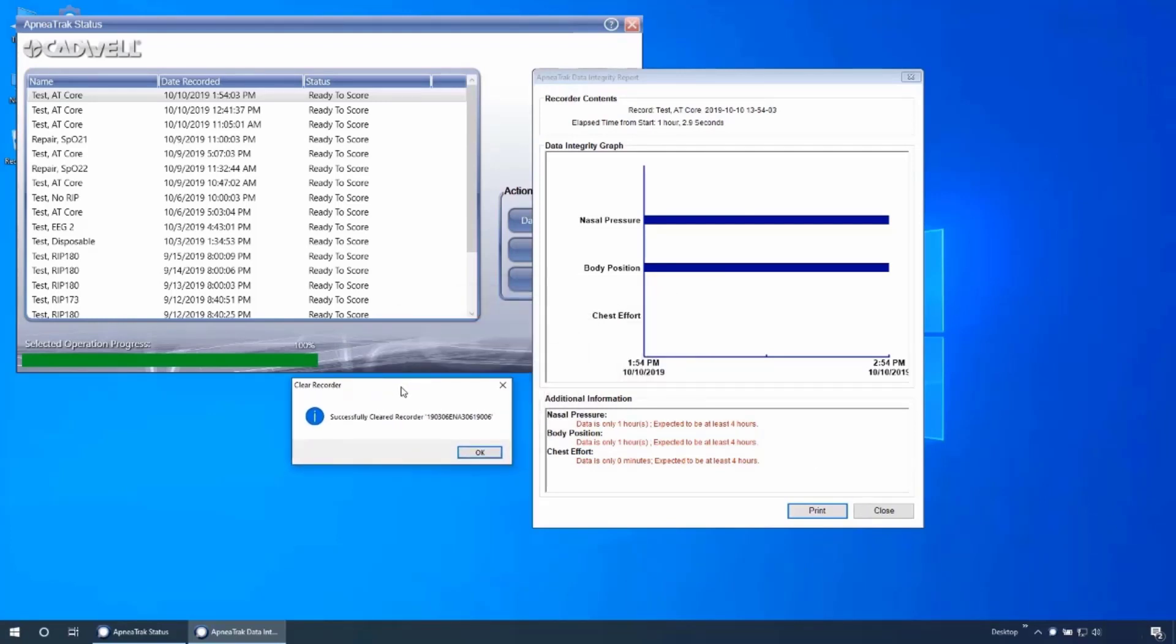The downloaded data has first been checked, page by page, to verify all data is present. The data is not retrievable after the device has been cleared. This keeps the memory on the device healthy and more HIPAA secure.